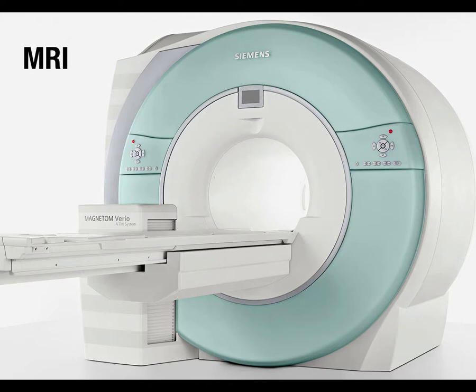And as we'll probably touch on a little bit, the difference between the field strengths of 1.5 to 3 Tesla to 7 Tesla really comes down to the quality of the image that you get. Once I get to contrast generation today, we'll talk a little bit more about this, but basically we're trying to maximize the contrast, or the difference in signal, between different tissue types. And the stronger the magnetic field, the more you can separate the signal from those different tissue types.